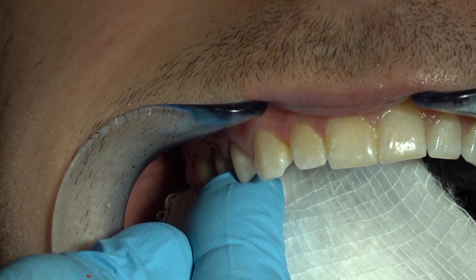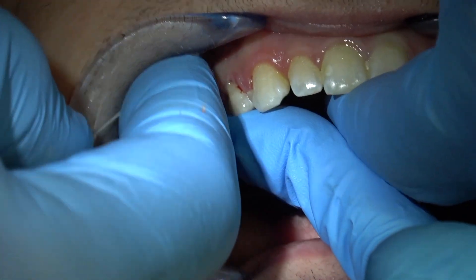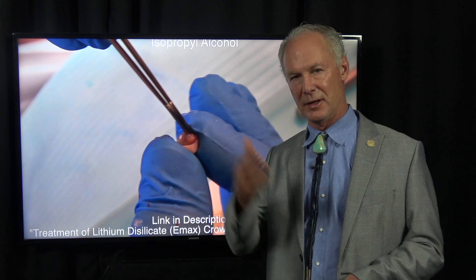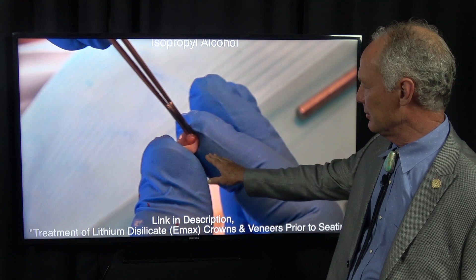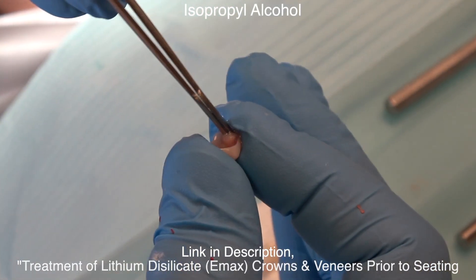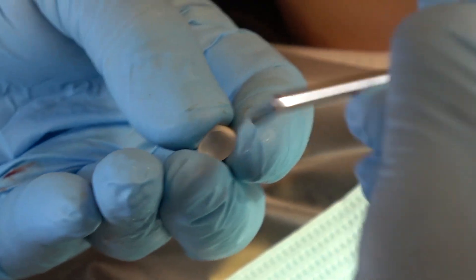We'll floss them — this is unwaxed floss because it's thin and it'll break if it's too tight. You don't want to floss all the way down to the gingival tissue because you don't want it to bleed again. If it starts bleeding again, repeat that 38% phosphoric acid placement and rinse it off with ice cold water one more time. These are Emax or lithium disilicate crowns, so the laboratory has treated them already. You can refer to that link on how to treat lithium disilicate crowns. Once we've tried them in the mouth, we come back and wipe them with isopropyl alcohol and dry them really well.